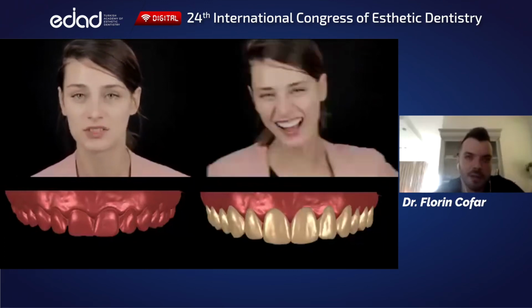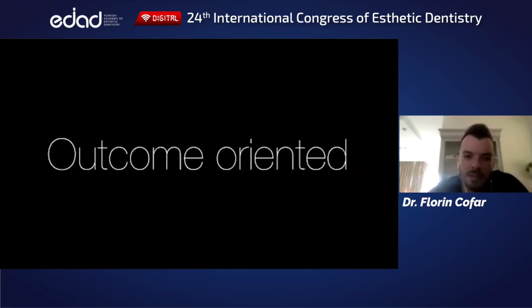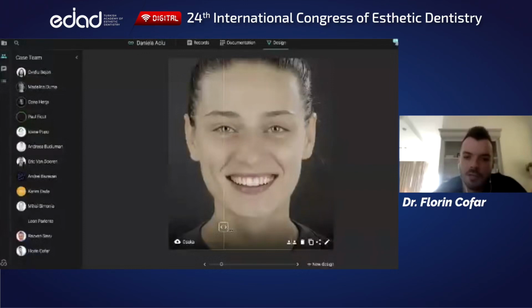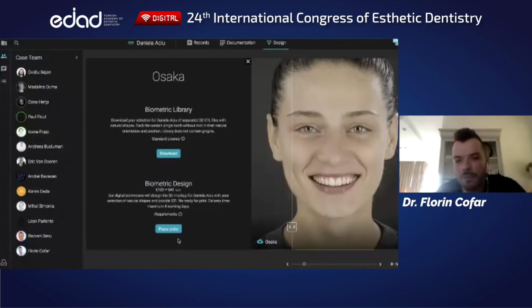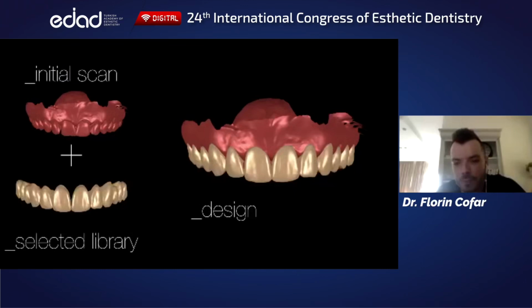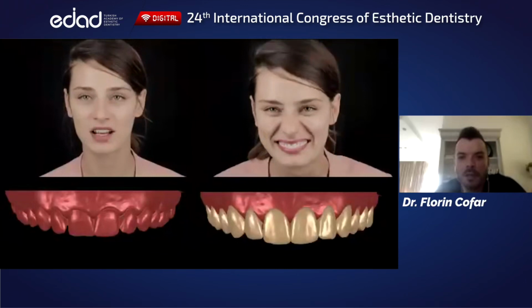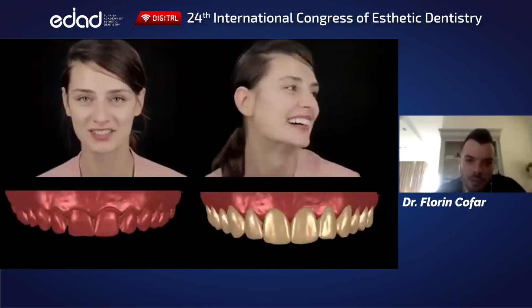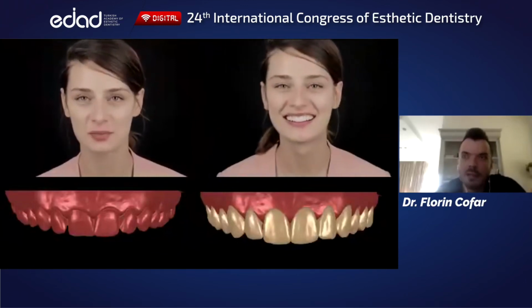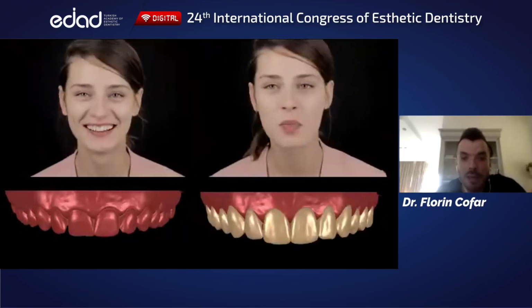I mean, it's a very small percentage of cases that are purely additive. So remember that this is an outcome-oriented step. Either you're going to use just a virtual tool to render the library and then go immediately to design a final one, or you print it and transfer it in the mouth to do a before and after video. Your outcome at this point, at the 2D phase, is deciding what library you're going to use according to the face of the patient and getting the case acceptance.